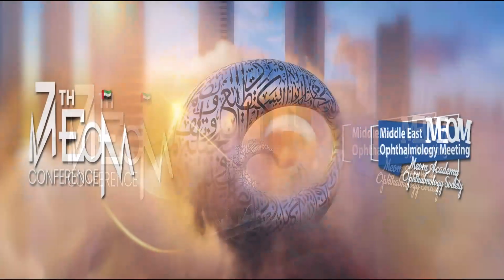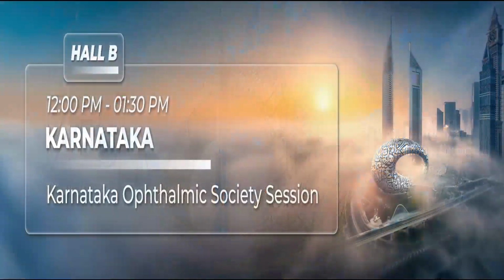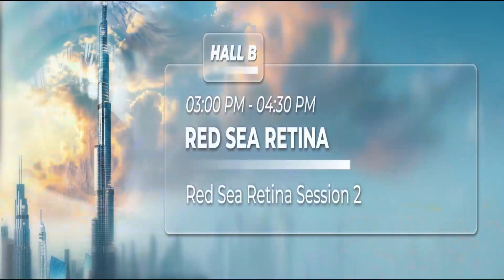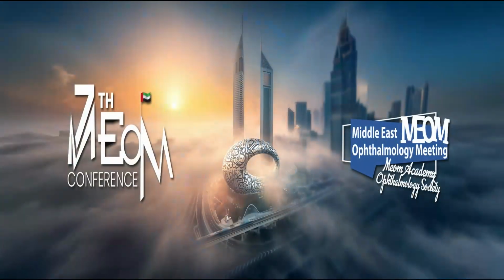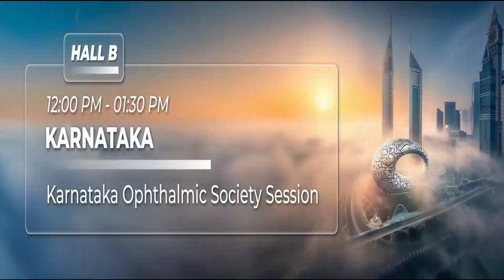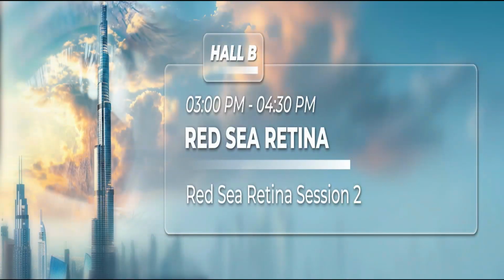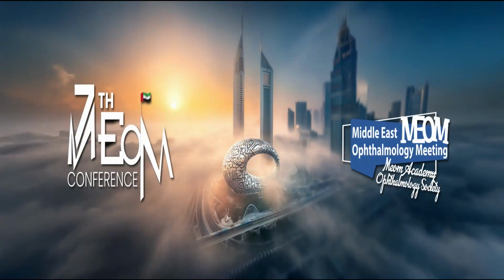So I've done the direct PFCL oil exchange. I think it's very fiddly, number one. Number two, I think you can only do it on the Alcon vitrectomy machine. With the Bausch and Lomb vitrectomy machine, you'd have to have a third hand to do it manually. You can't do a direct heavy liquid oil exchange. With the air, I've done it once. I've had a bad slippage and never again. And I'm sticking with the PFCL for my approach.